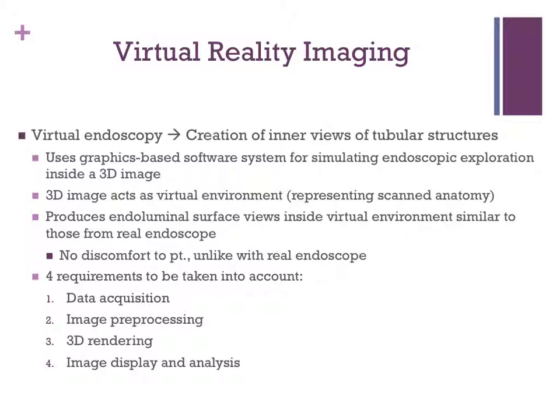Virtual reality imaging. Virtual endoscopy is the creation of inner views of tubular structures. A virtual endoscope is a graphics-based software system used for simulating endoscopic exploration inside a 3D image. In virtual endoscopy, a 3D image acts as a copy or a virtual environment representing the scanned anatomy. With the assistance of computer-based rendering tools, a virtual endoscope produces endoluminal surface views inside the virtual environment similar to those from a real endoscope.